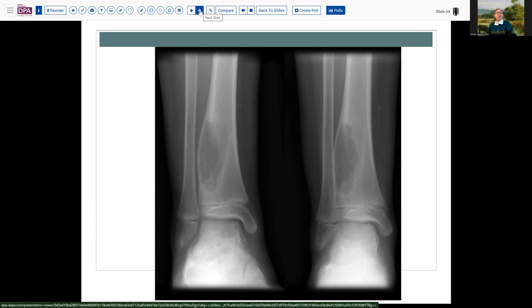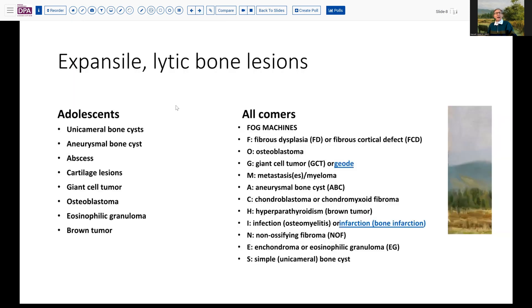With this radiographic appearance, you can imagine that our radiologists were immediately jumping on a number of possibilities. When the radiologist looks at a lesion like this, they're going to consider the sorts of things that might occur in this location, as well as the age group in which the individual is presenting. There are a number of considerations that can cause somewhat expansile and lytic lesions. This acronym, FOG Machines, has been advocated as a way of remembering all the various possibilities to be considered.